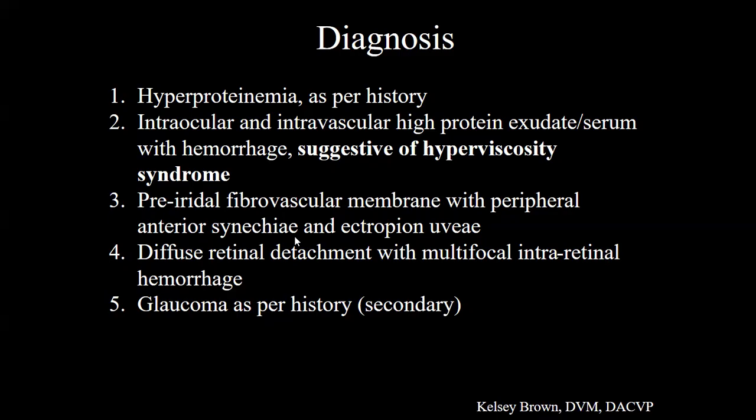Yeah, maybe like that, maybe a little bit extended, just because the red blood cells, since they're floating in the vitreous and aqueous, which is a little bit more of a nourishing environment, I think red blood cells can remain viable a little bit longer than just outside of vessels in the solid tissue.